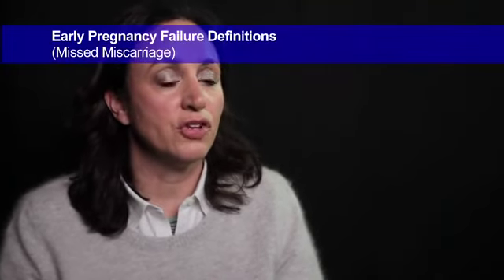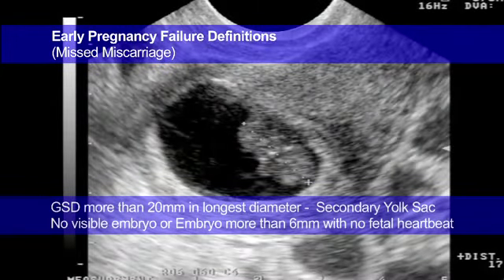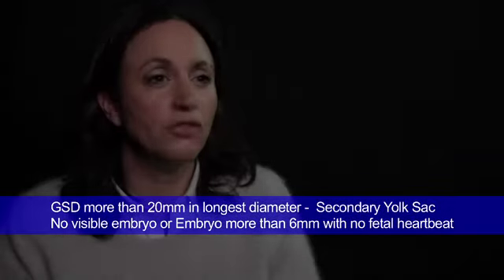So once we are quite certain that the absence of a fetal heartbeat is truly representative, then we also measure the gestational sac diameter. If the gestational sac diameter is more than 20 millimeters in its longest diameter, there is a secondary yolk sac, and there may or may not be an embryo visible. If there is an embryo of more than 6 millimeters in size with no fetal heartbeat, then we can diagnose a missed miscarriage.